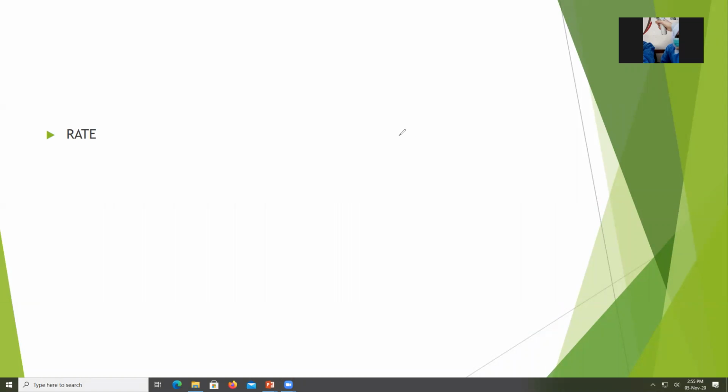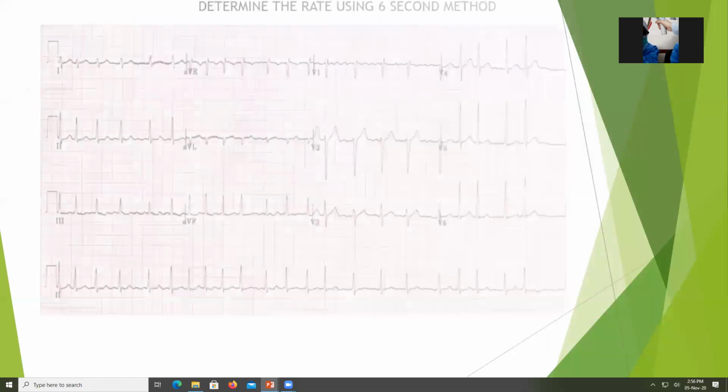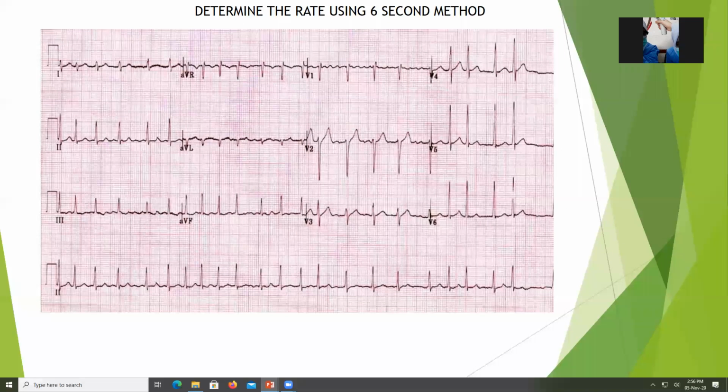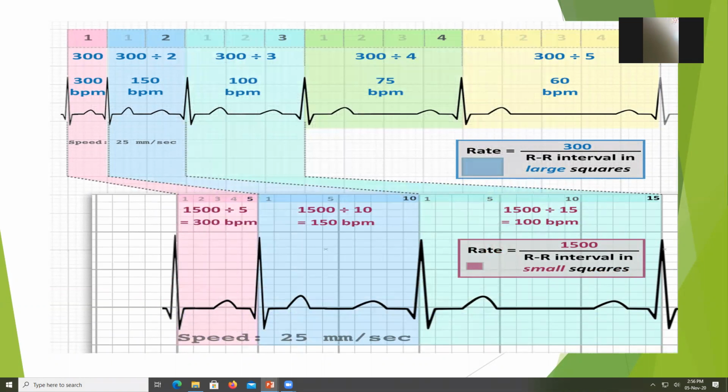Okay. Let's now discuss the rate. This is one of the challenging parts. For example, this one, how can you determine the heart rate? The heart rate of this one, if I'm going to use the big square method, is around 150 beats per minute. So what is the big square method? How can you easily identify the heart rate of the ECG result by just computing the small squares and big squares? So here is how it is.